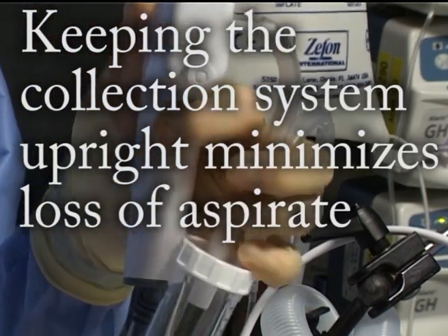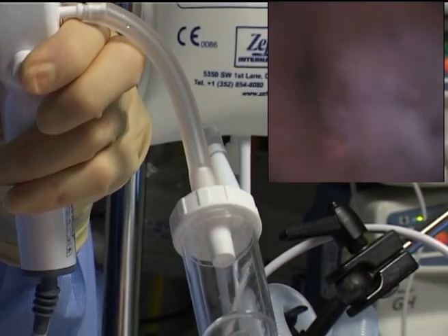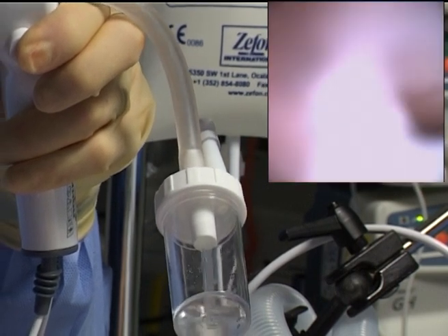Keeping the collection system upright minimises the loss of the aspirate. You can see here the aspirate is sucked into the sputum trap.